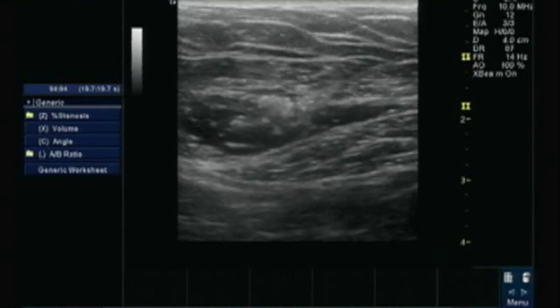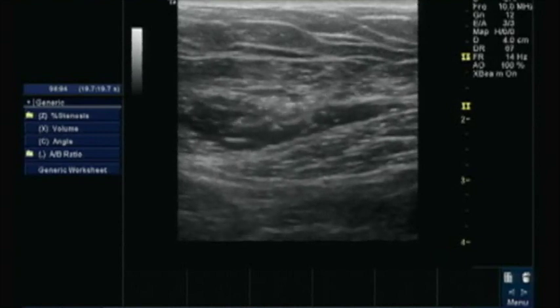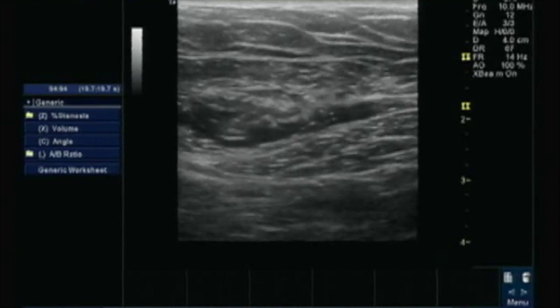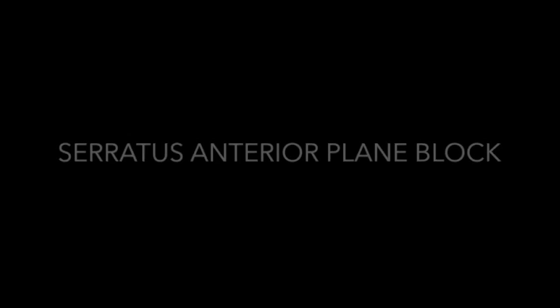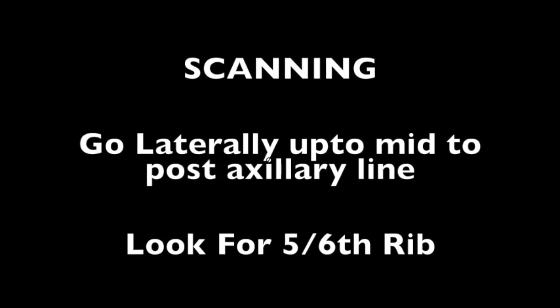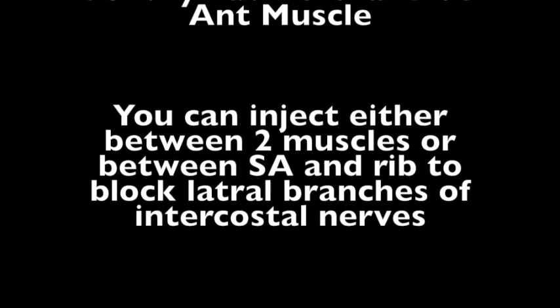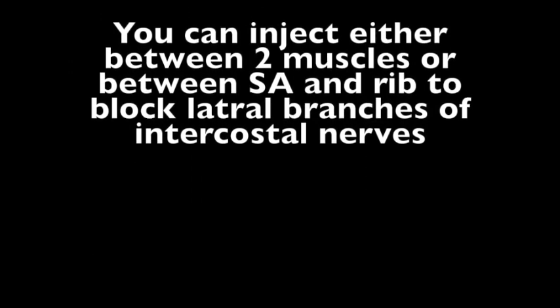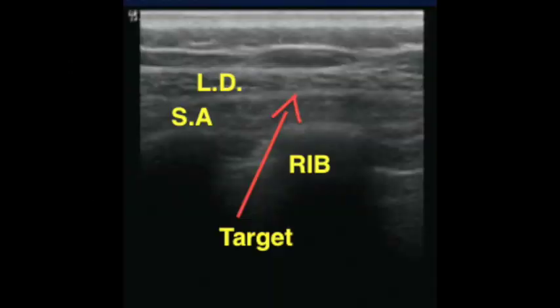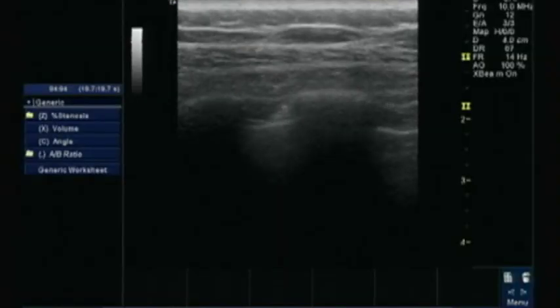This will provide excellent analgesia, but it is not sufficient for modified radical mastectomy. So I will supplement it with serratus anterior plane block. Serratus anterior plane block is a little posterior and it will block T2 to T9. For scanning, you have to go laterally, look for the fifth and sixth rib, and identify the latissimus dorsi and serratus anterior muscle. You can inject either between these two muscles or posterior to the serratus anterior.